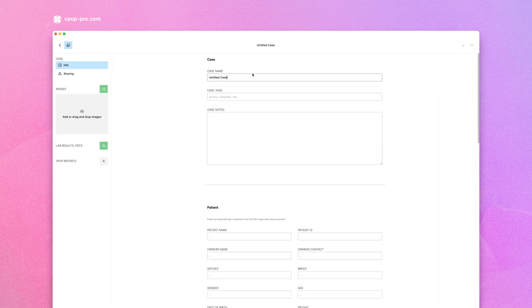In the Case Info area, you'll see fields to enter details for the case, patient, history, and surgery.